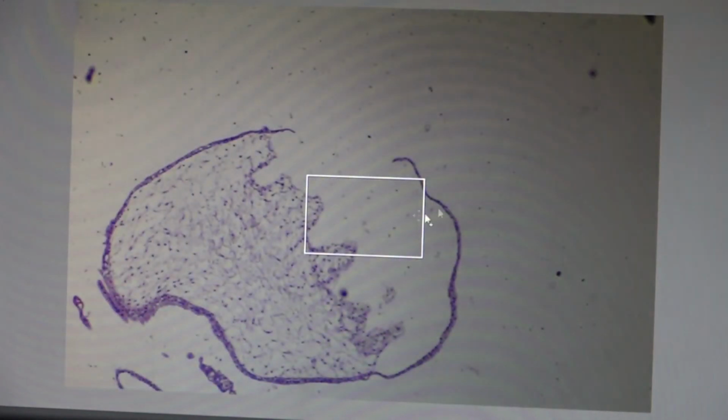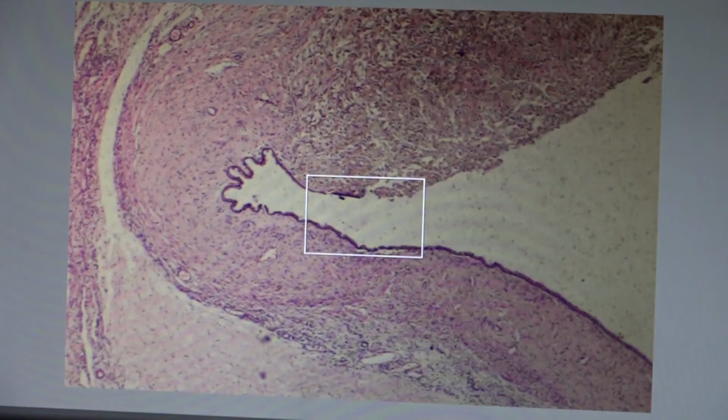This is another one. This is the large cistern and maybe ruptured, and these are the syncytio and cytotrophoblast. Syncytio and cytotrophoblast normally seen. This is hydatidiform mole, H mole, a benign lesion of the trophoblast tissue or benign lesion of the gestation, hydatidiform mole. Regarding the pathology of ovary, we have many lesions.